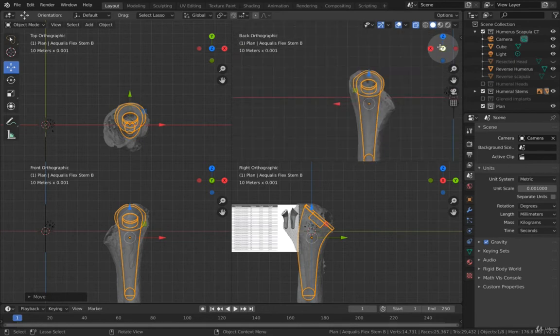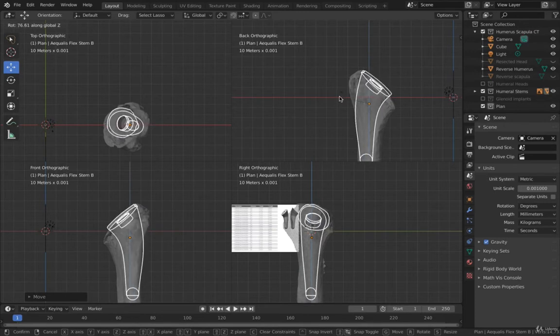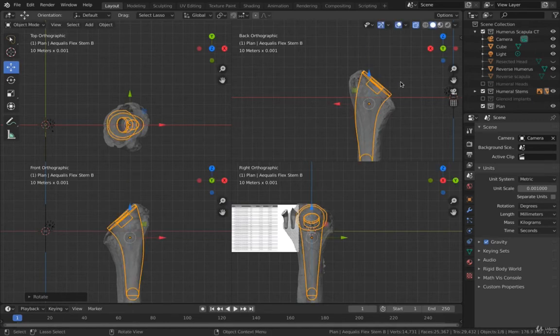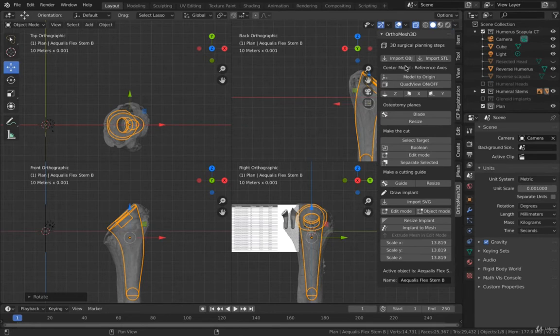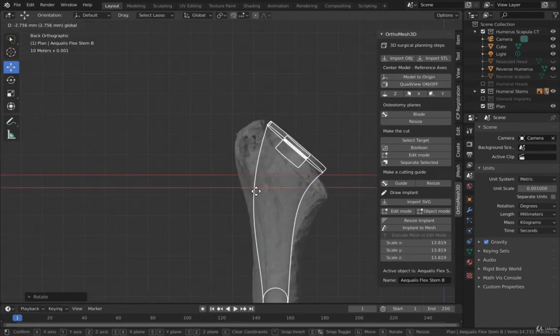So let's see here on this view, I have to rotate it on the Z axis. So I can just press R on the keyboard and then Z, and then rotate it this way. And it has to be about 90 degrees, so that's 94, 95, and 92. It's pretty good right there. Press N on the keyboard and go to quad view again. This needs a little bit of adjustment here.